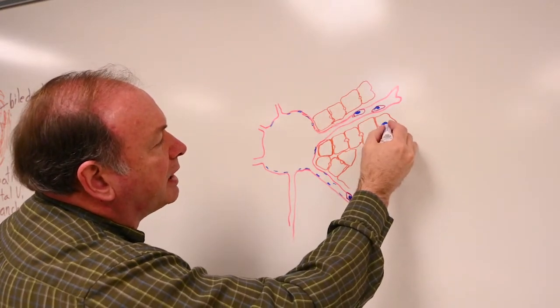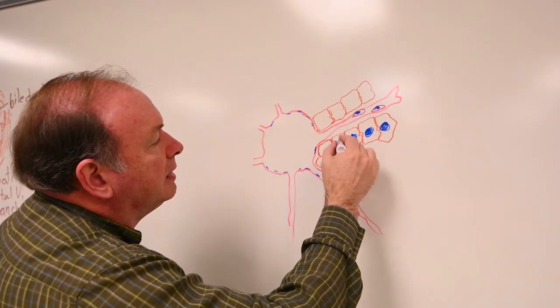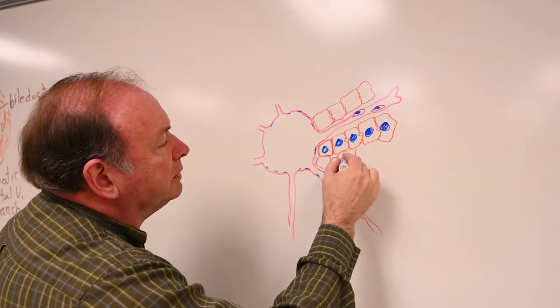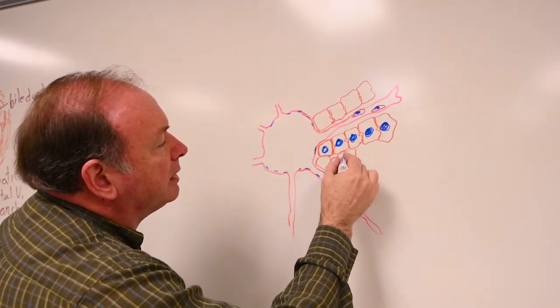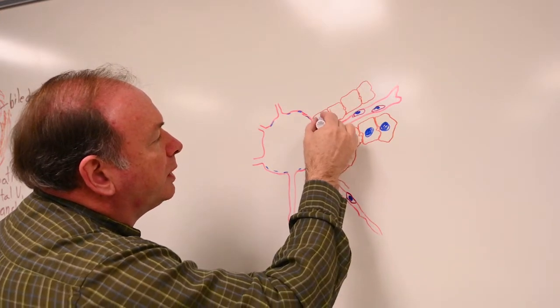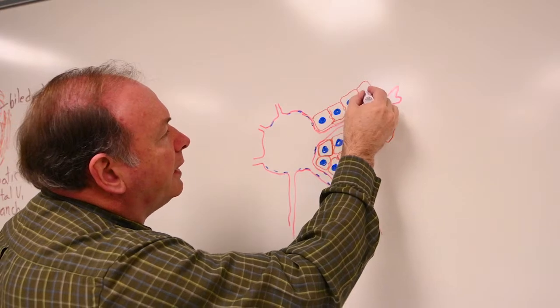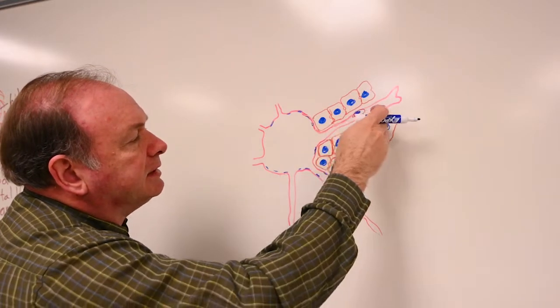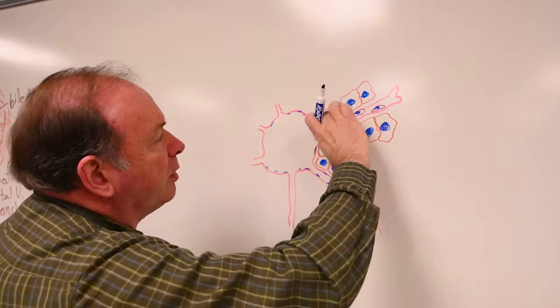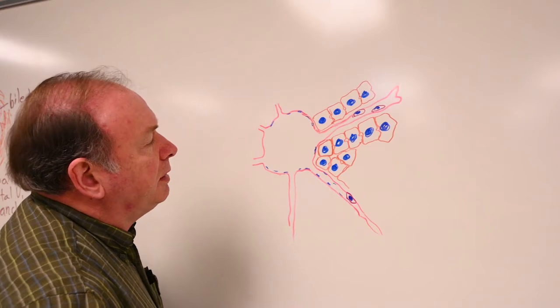These are hepatocytes. They have a large round nucleus, each of the hepatocytes. They're large, squarish kinds of cells, although they can be irregularly shaped in some positions. They don't form very good squares. For the most part, they're side-to-side cuboid-like cells that radiate out from that center and go along the length of each of the sinusoids out here.